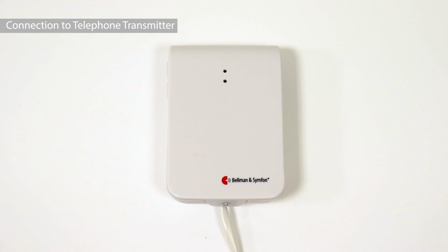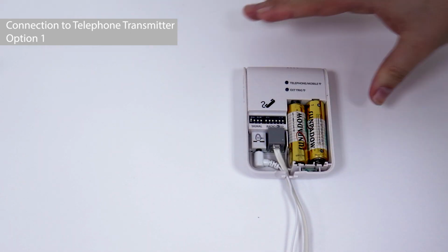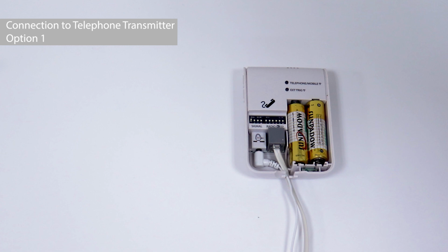To get started, we'll talk about connecting the mobile phone sensor to the other Bellman products. Let's start with the telephone transmitter. There are two different ways to connect to the telephone transmitter. The first connection is under the battery cover. Plug the mobile phone sensor into the port that has a picture of the mobile phone sensor.